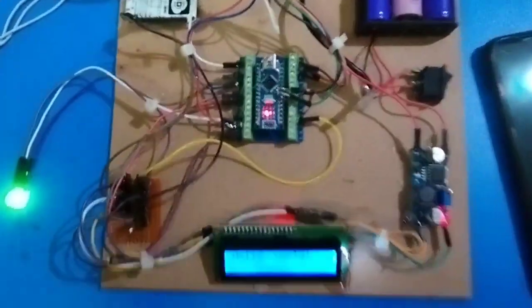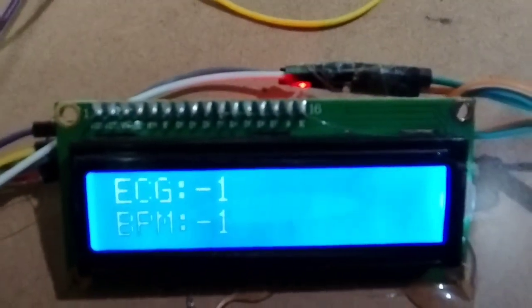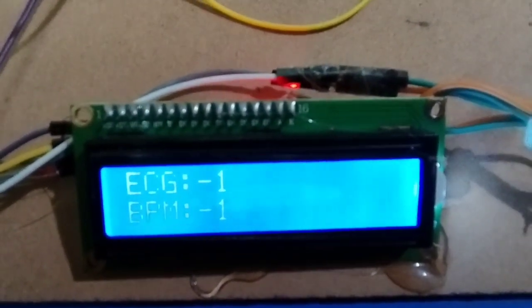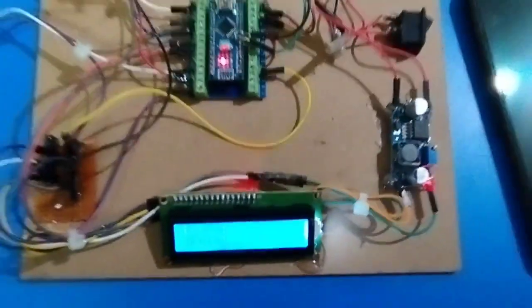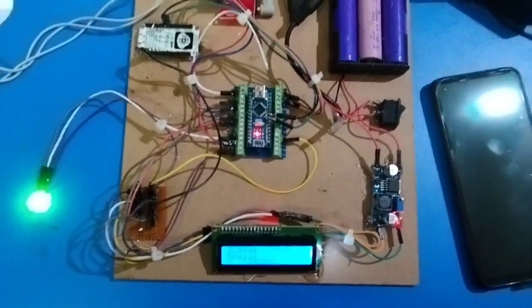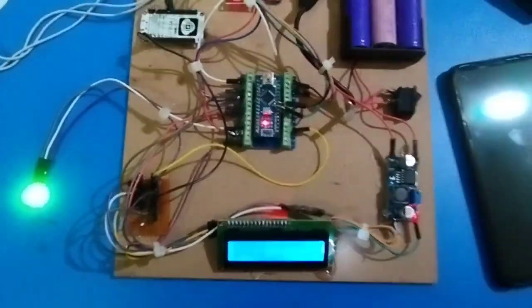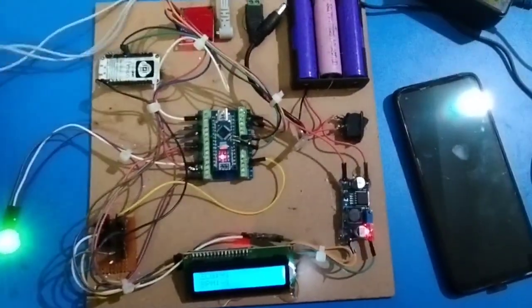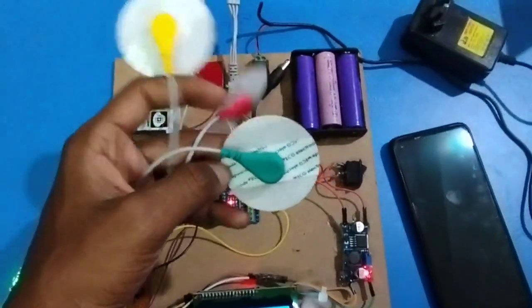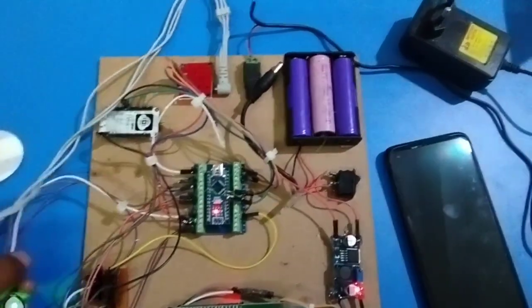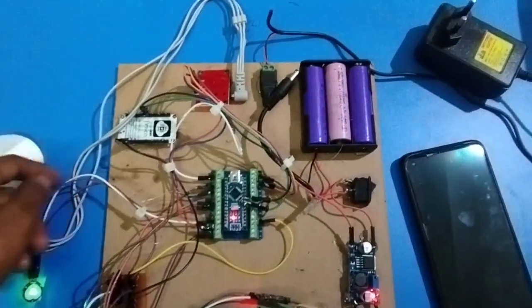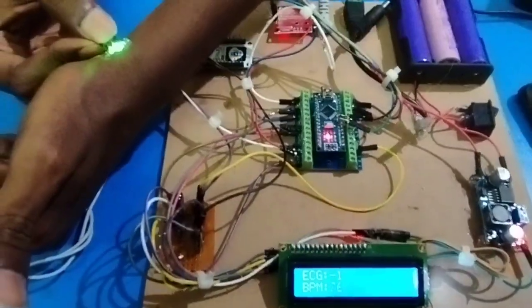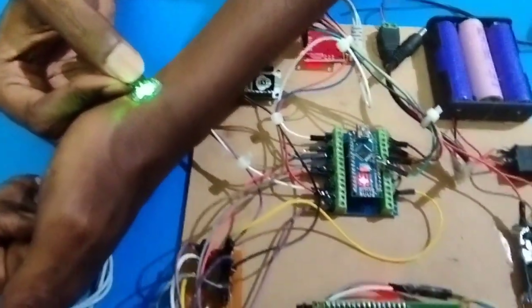You can see it's showing ECG -1 and BPM -1 because it is not initialized. We need to wait till it gets initialized. This is the ECG sensor and this is the pulse sensor. We have to place them on our body so that we will get the data. So we kept the ECG sensor positioned.